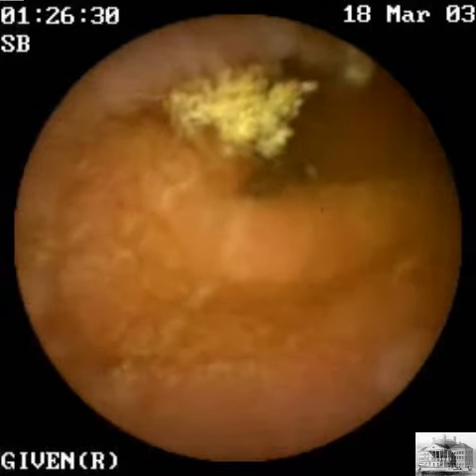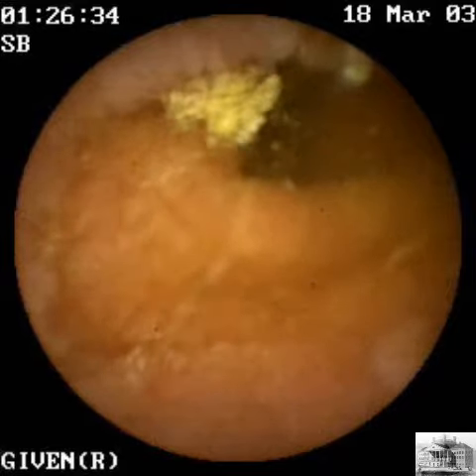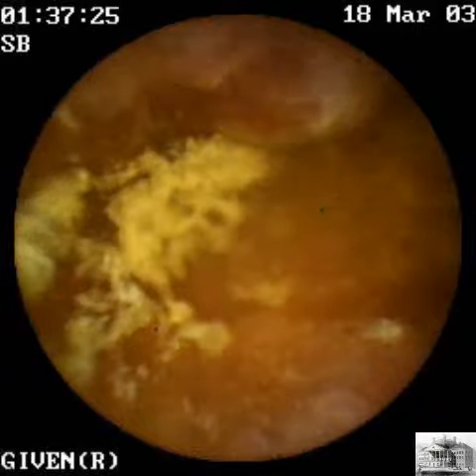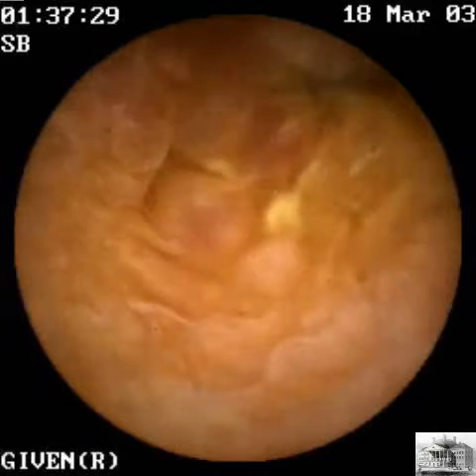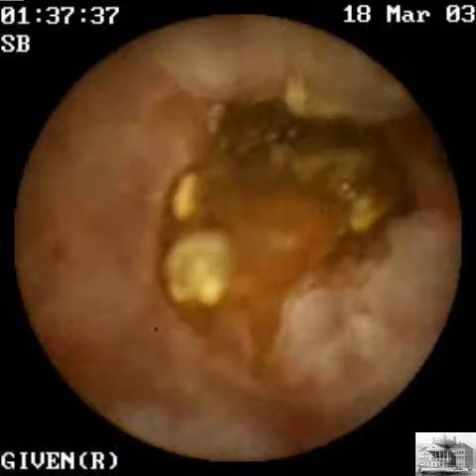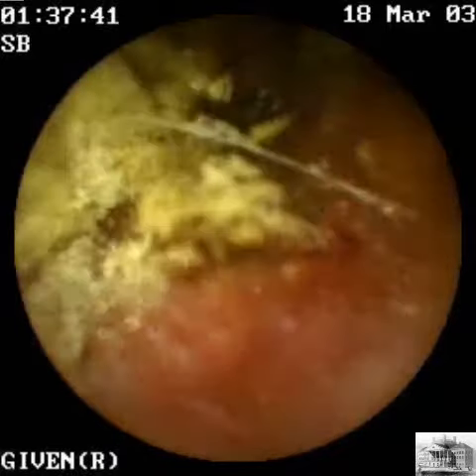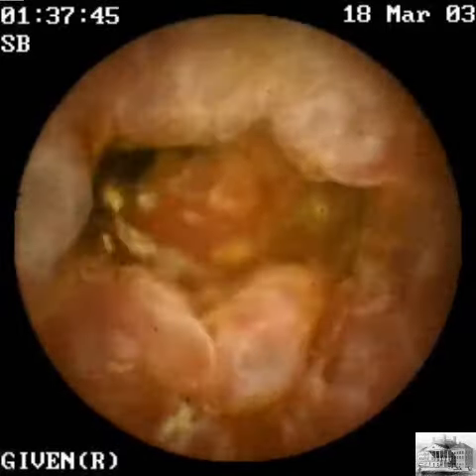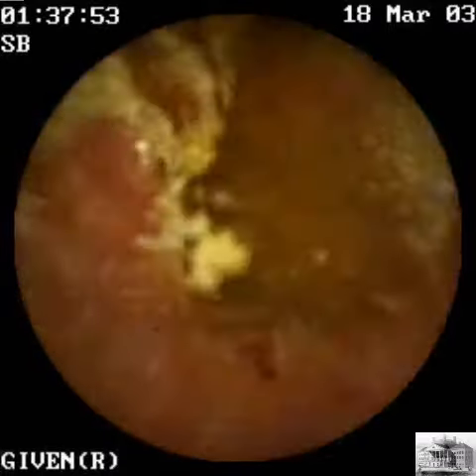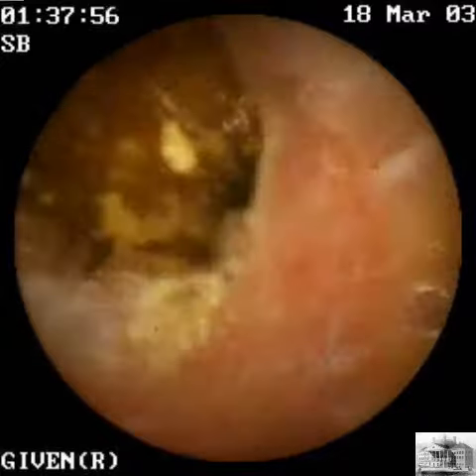Prior upper endoscopy, colonoscopy, and abdominal CT scan suggested graft versus host or GVH disease, and this capsule study was performed to determine the extent of small bowel GVH involvement. These ulcerated nodular changes were seen throughout the small bowel and are typical for GVH enteritis.